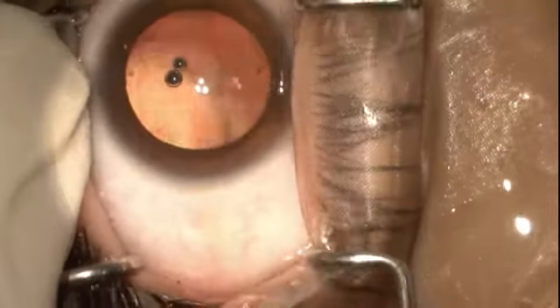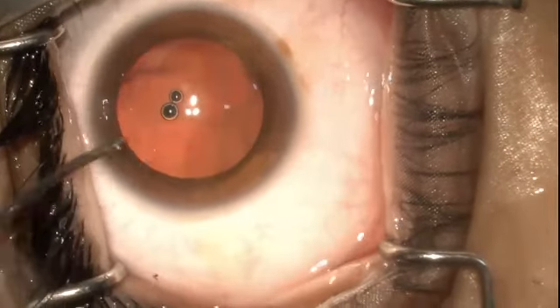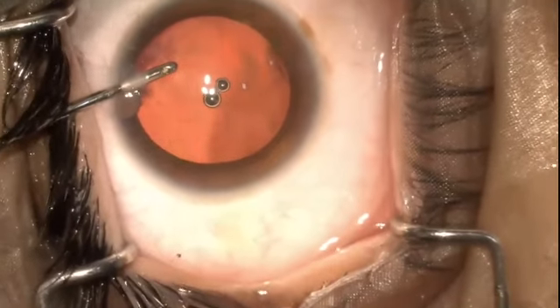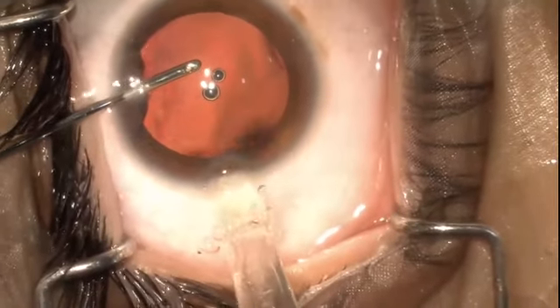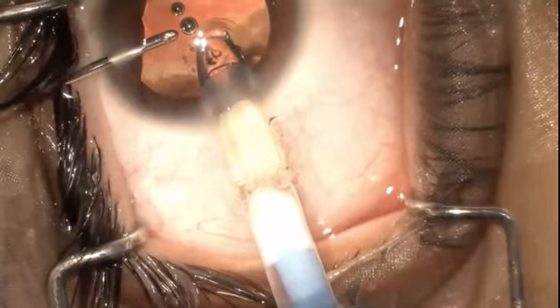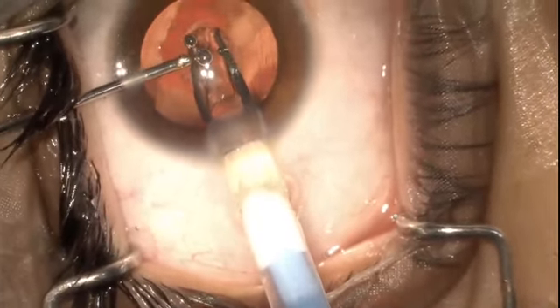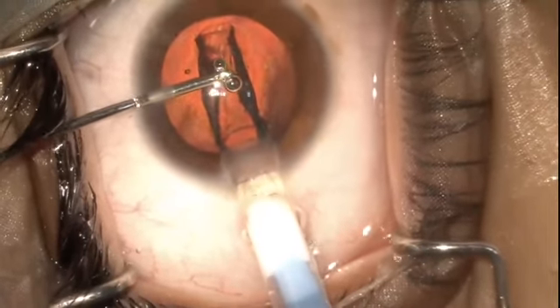Once you are sure that the lens moves, then again put the speculum, inject the viscoelastic, and inject the ICL slowly. Take your own time while injecting the ICL. The haptic which has a hole should open on the right upside.